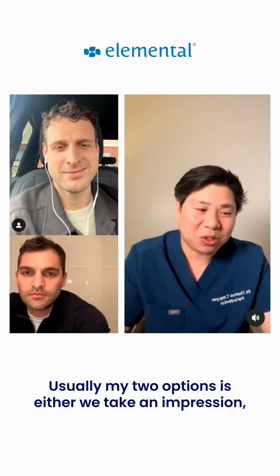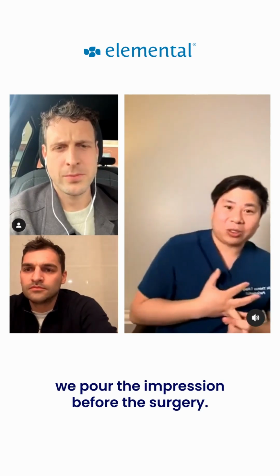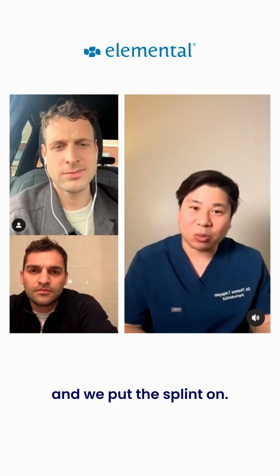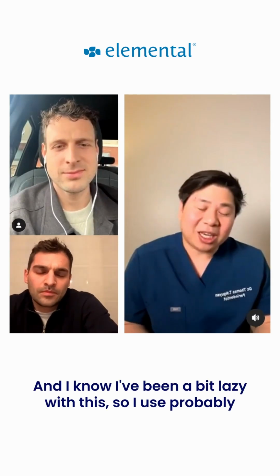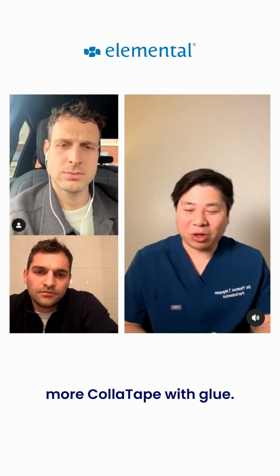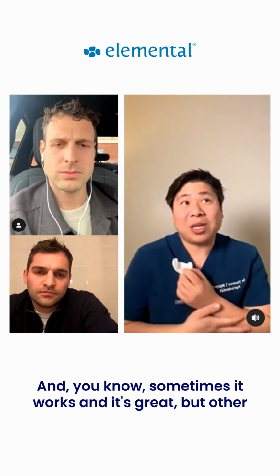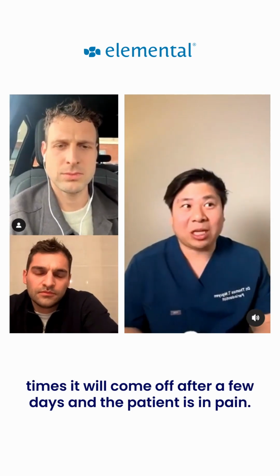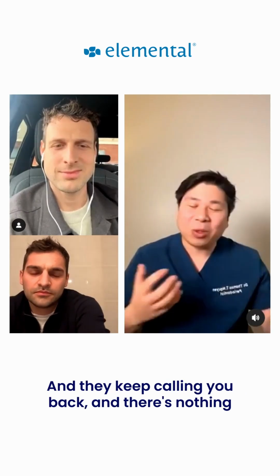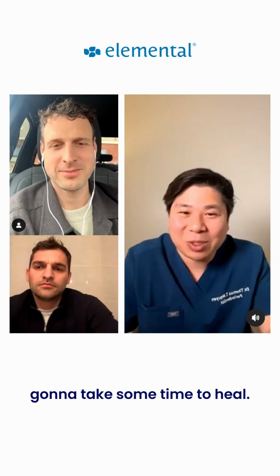Usually my two options are either we take an impression, we pour the impression before the surgery, then we create a splint, then the patient comes and we put the splint on. And I know I've been a bit lazy with this, so I probably use more Coe-Pak tape with glue. And sometimes it works and it's great, but other times it will come off after a few days and the patient is in pain and they keep calling you back and there's nothing you can do. So you tell them, sorry, it's just going to take some time to heal.